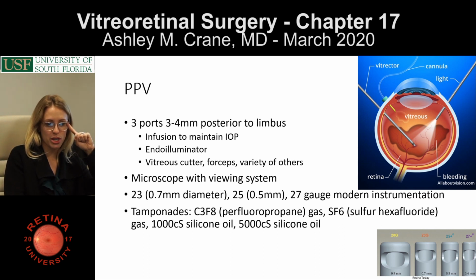It goes through a third port, and several other instruments can be used instead of the vitrector, and you can even put in a 4th port with a lighting system that is not manually controlled, and use both hands with some of these instruments. And then you're looking through the microscope with an indirect viewing system with an inversion mechanism, which might be in your hospital a BIOM or a Resight. It's attached to the microscope.